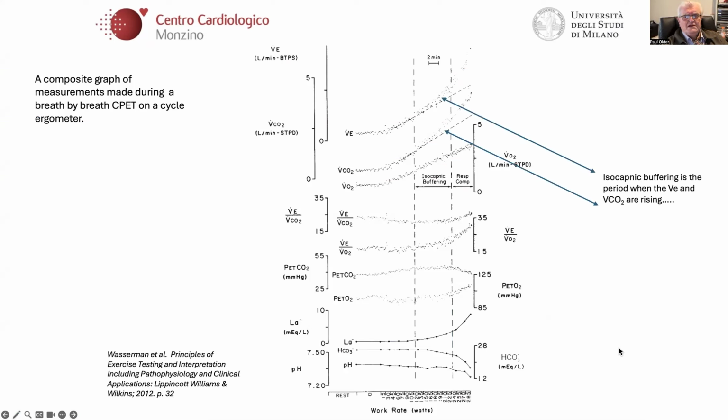Isocapnic buffering is the period when the VE and VCO2 are both rising. There we are, there. But the VE, VCO2 is not.